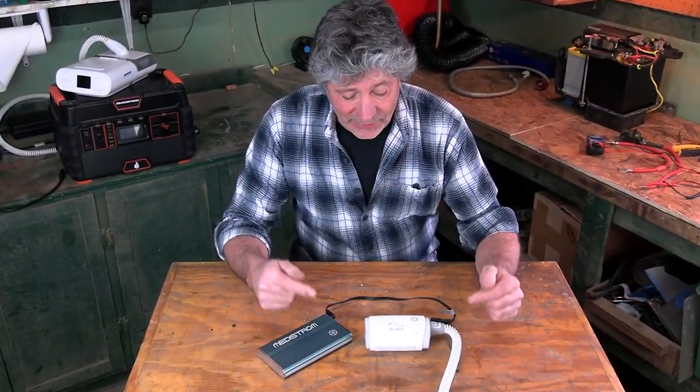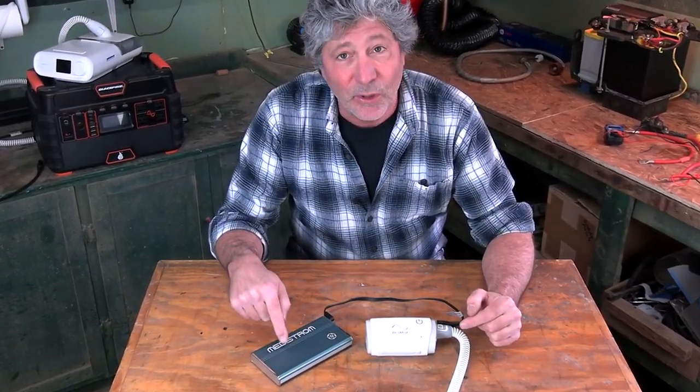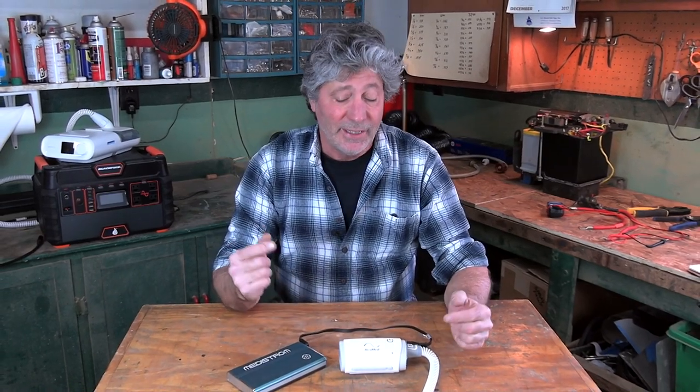Believe it or not, this is a fully functional CPAP machine with its own power supply. I know, I was a little skeptical at first too, but I've been using it every night for the past three weeks testing it, and let me tell you, it performs every bit as good as my larger unit.